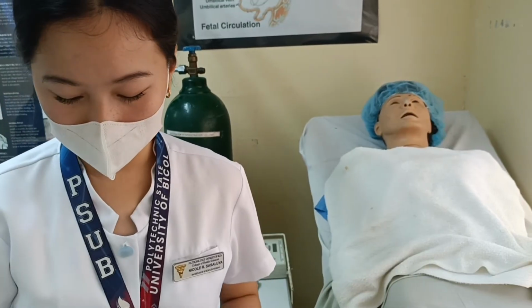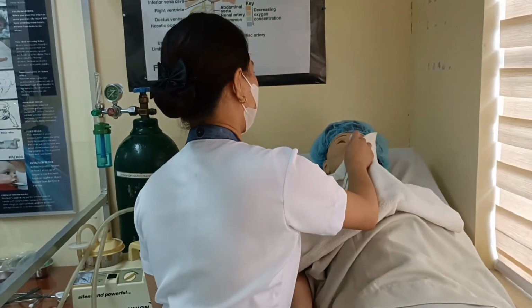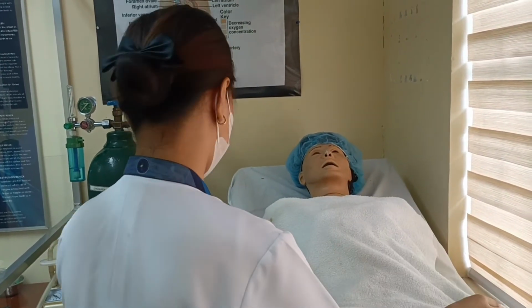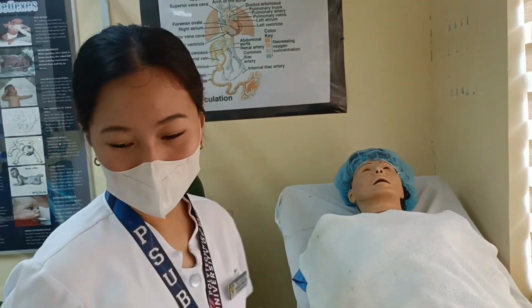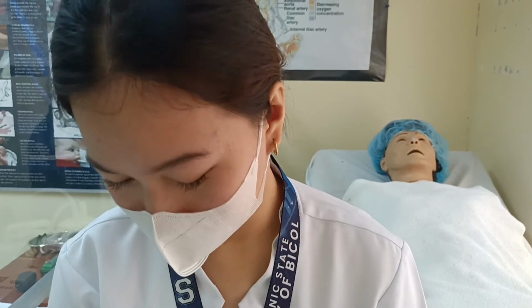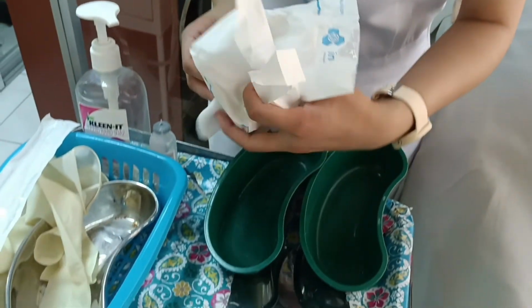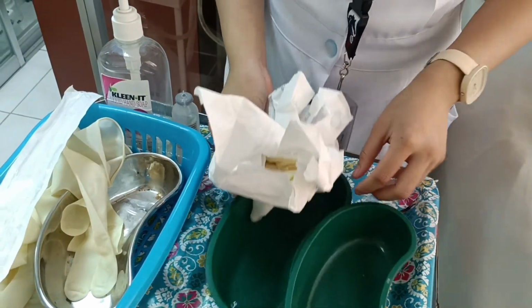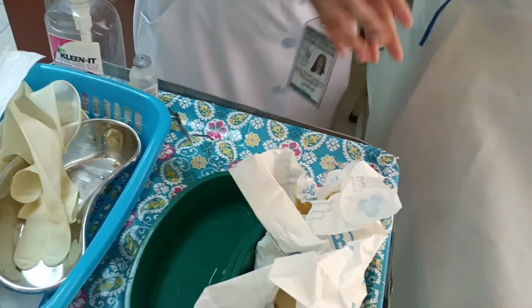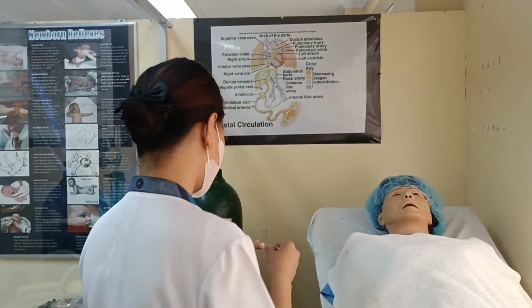So we are going to assess the client. And then after, ma'am, let me help you to wipe your mouth. Then we are going to dispose of the equipment. We are going to assess the effectiveness of the suctioning.